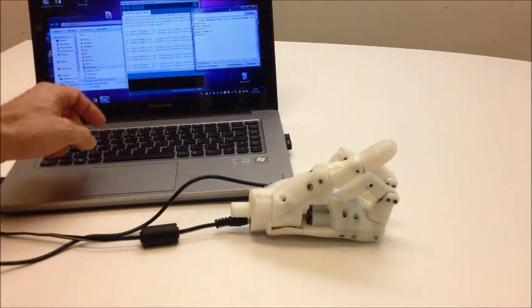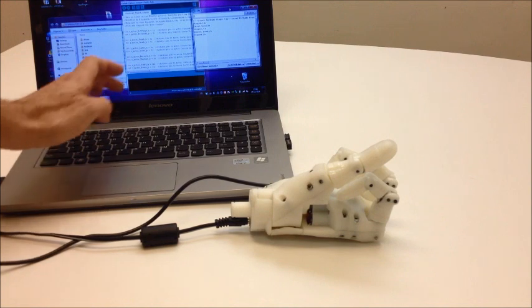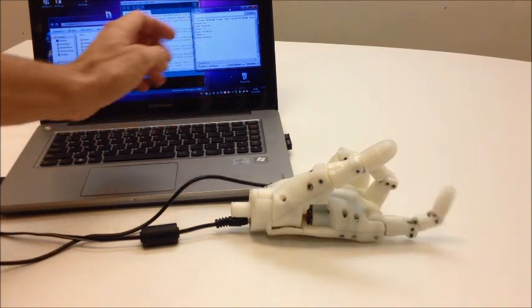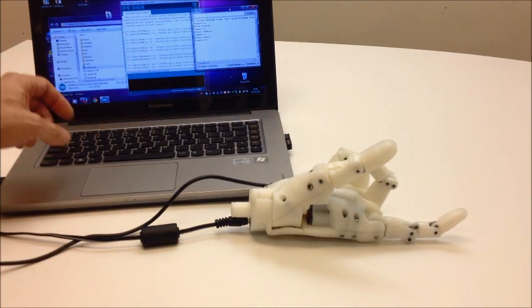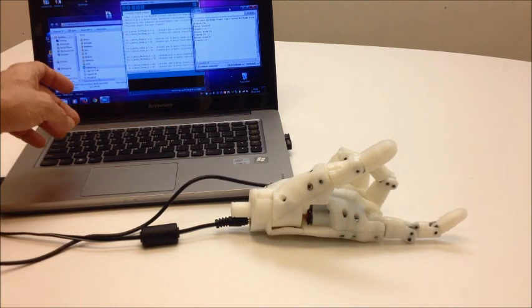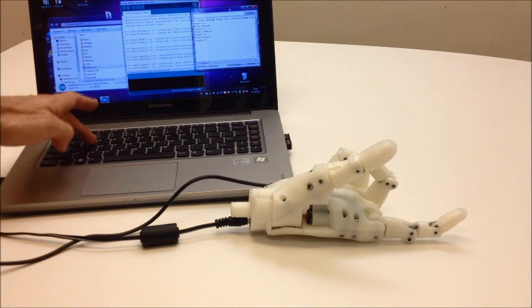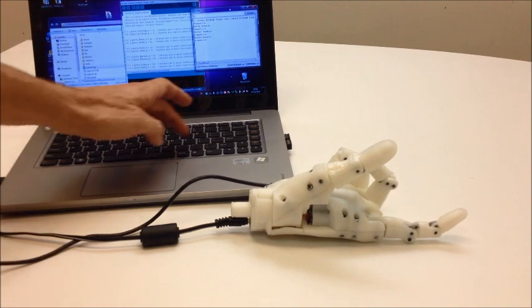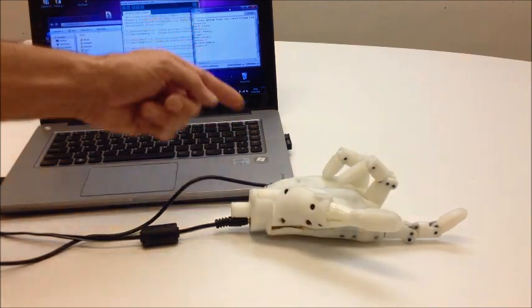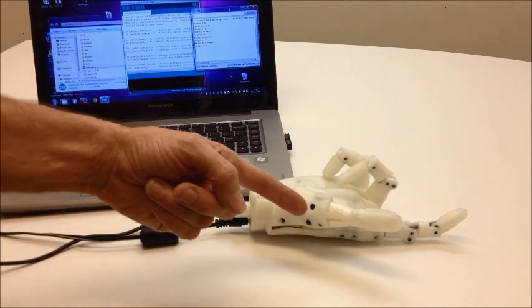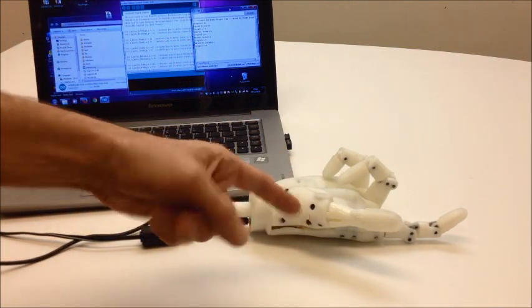I press C, it opens the index and then if I do W, then it's opening the thumb.